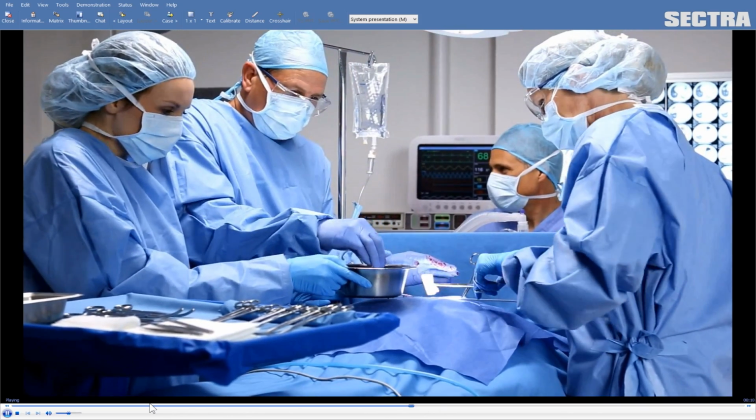Getting these sort of files into the system in the first place is a major challenge. And that is because these files do not come in the standard DICOM format that we have in radiology. And therefore, we do not have any possibility in the transaction protocol to get the patient's clinical metadata linked up with the actual file. Now, for the operating room, we have dedicated solutions, as well as for the endoscopy labs.